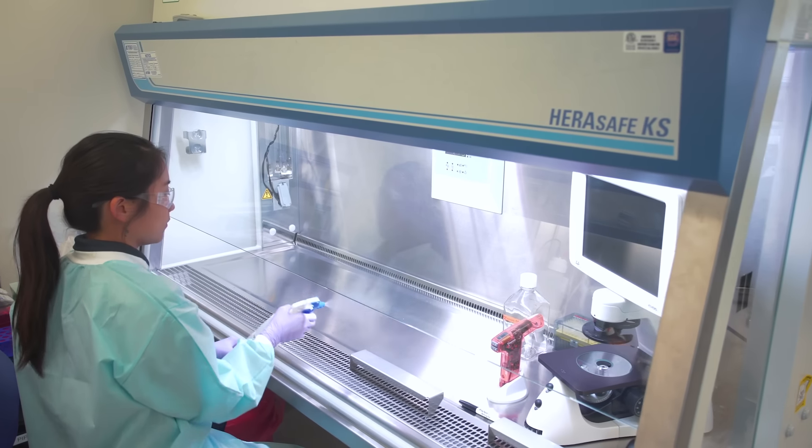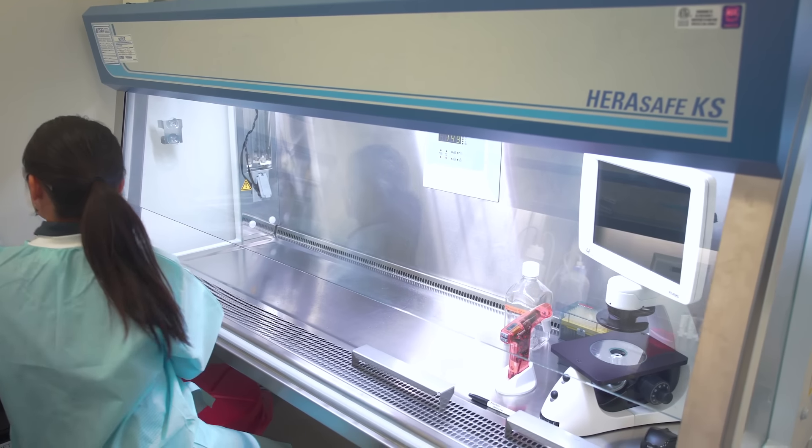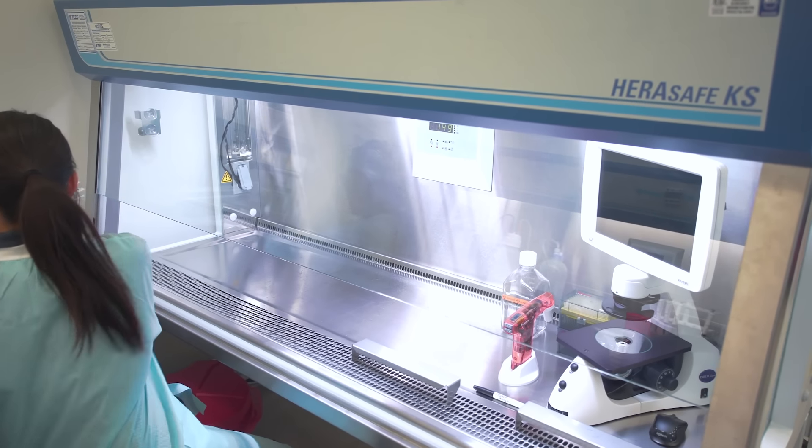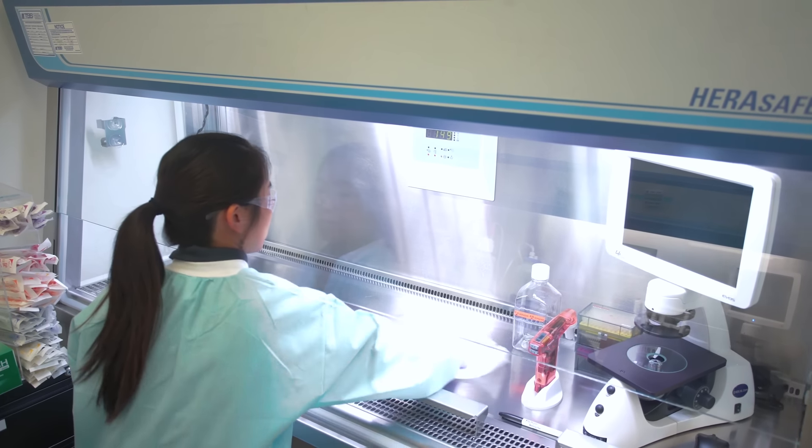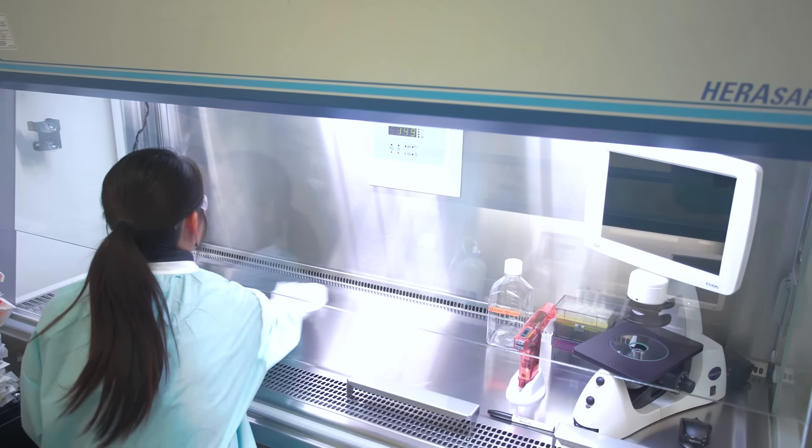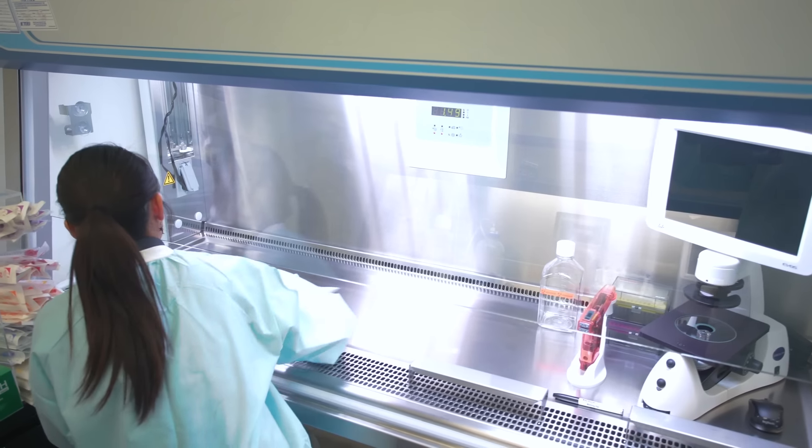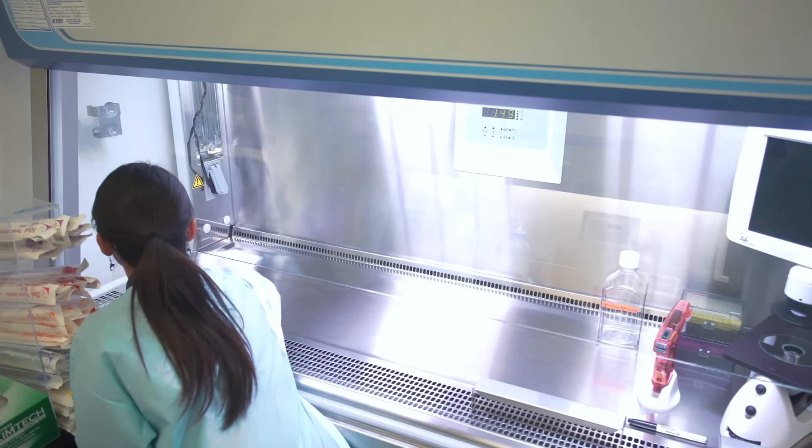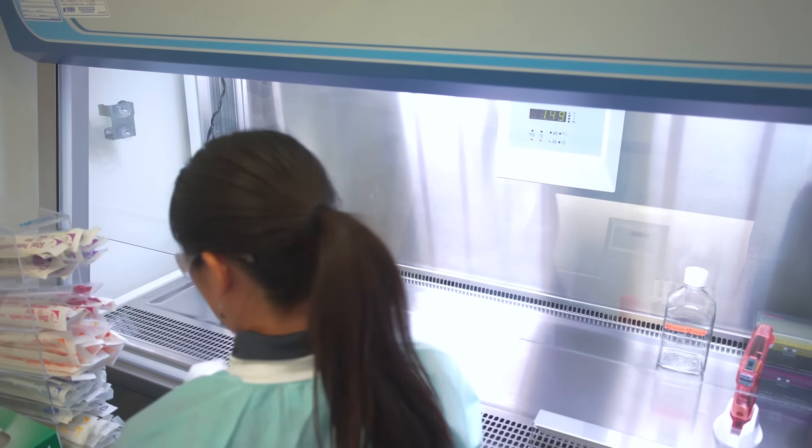Thawing cells is a very stressful process for them to endure. To aid your cell survival, perform each step quickly and under optimal conditions such as temperature, medium formulation, and seeding density. Clean and set up the cell culture hood before you remove the cells from liquid nitrogen storage.